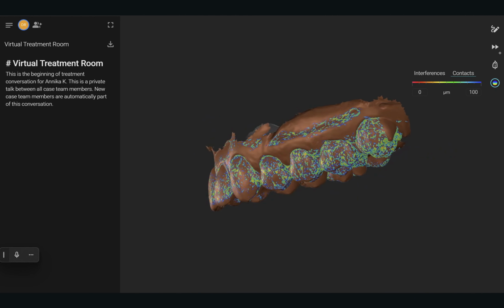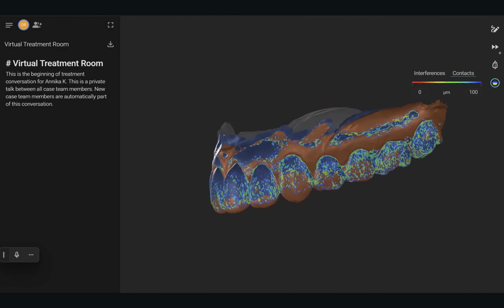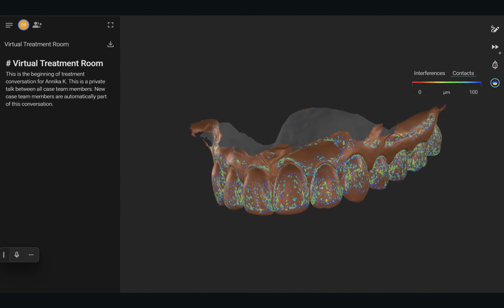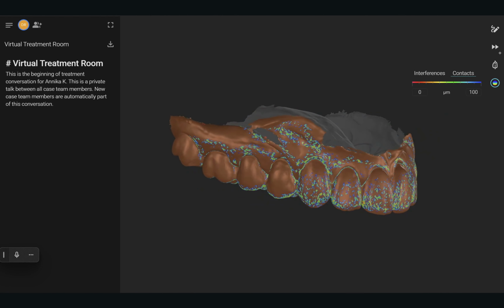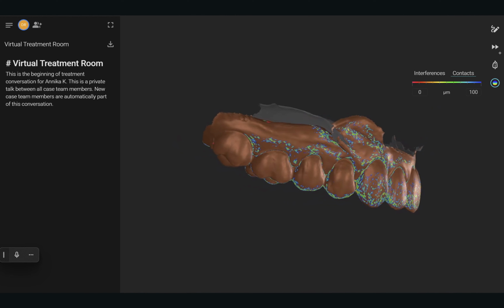And in fact, if anything, she had been not wearing her aligner retainer of an evening, because I could see that quadrant 1 had shifted and had lost a bit of the expansion we'd built over time. And so my hygienist came back because the patient was inquiring how much it had moved, and I could assess and find that it had moved somewhere between 0.1 and 0.2 millimeters, 100 to 200 microns.